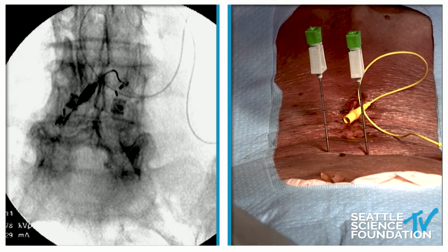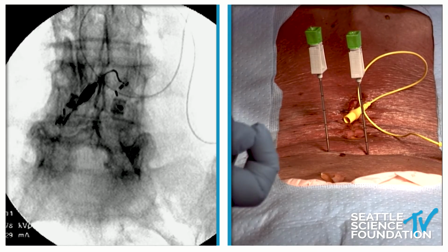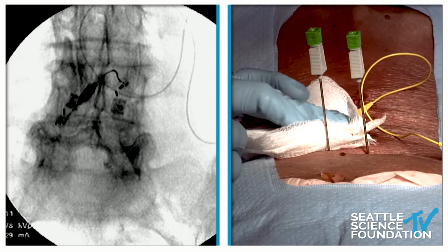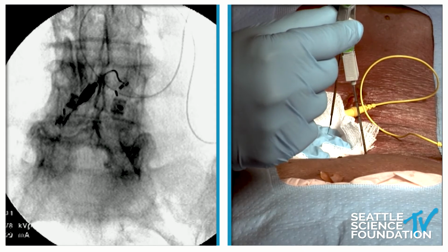And we'll take those off to the side. And Mason, if you don't mind popping those off. And what I'll do with the 4x4, this is the fun part, is that lead now has a tine in the tissue, in the multifidus muscle. So what I'll do is hold pressure on the multifidus, and then I'll pull back, and that didn't catch.